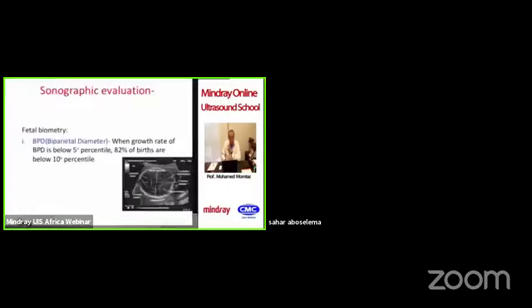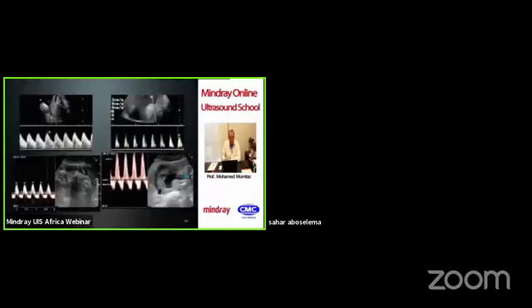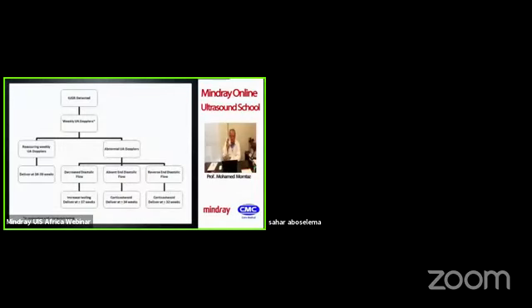Of course, it's very difficult to talk about IUGR in the same lecture. I'll skip the slides of IUGR and go directly to how to use the Doppler in cases of IUGR, because this is the most important thing. If you have an IUGR detected, you will do a weekly umbilical artery Doppler. If you find a reassuring umbilical artery Doppler, you will deliver at 38 to 39 weeks.